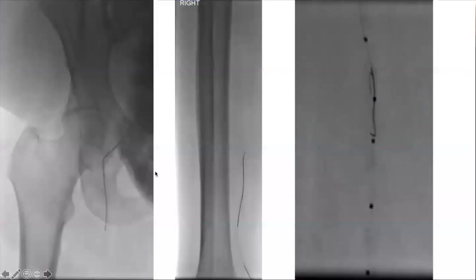As you can see here, this is the micropuncture needle sticking the common femoral artery under ultrasound, and this is the Nitrex wire — you can see the wire coming down the SFA. It's good to oblique the II ipsilaterally so you can see the wire going down the SFA much easier. You know that you're not going into the profunda by obliquing — in this case in the RAO position.